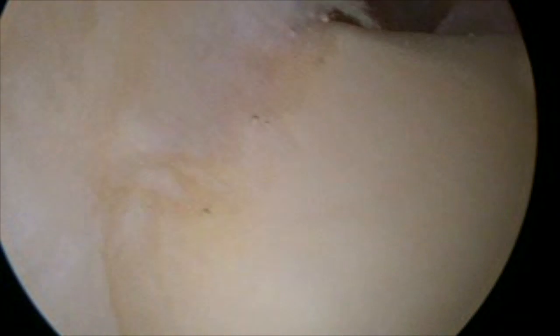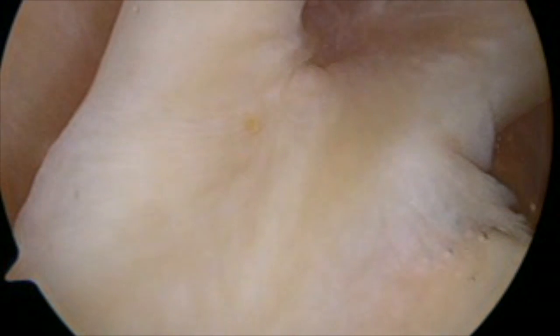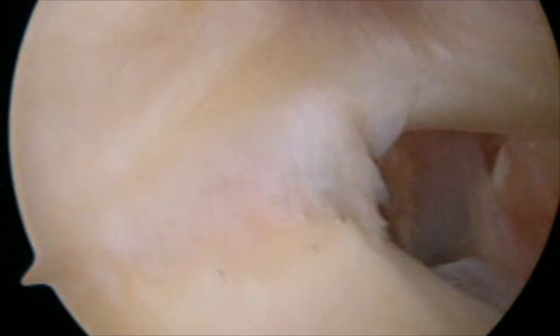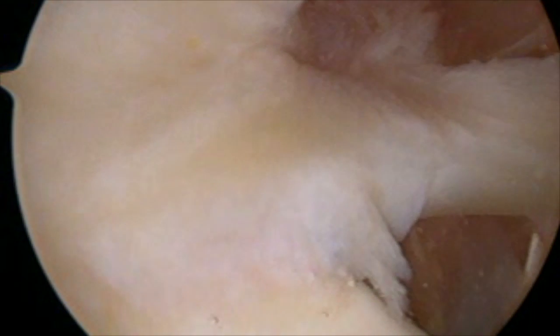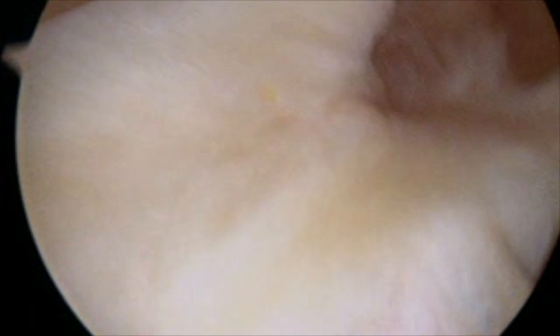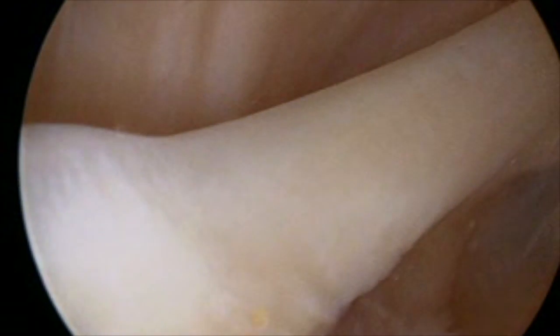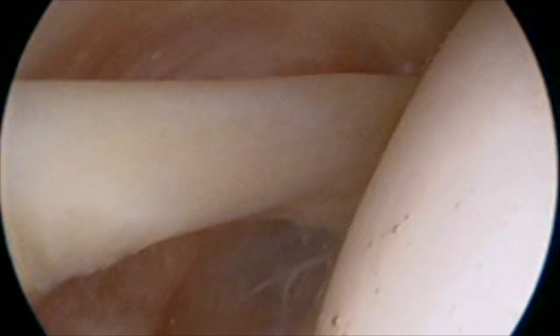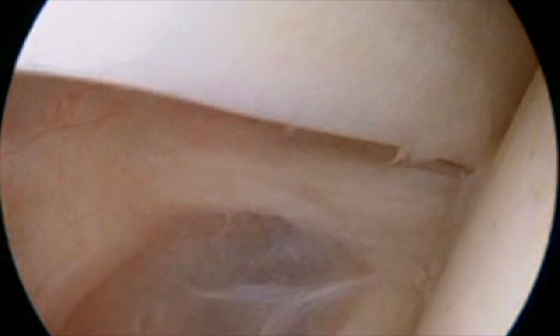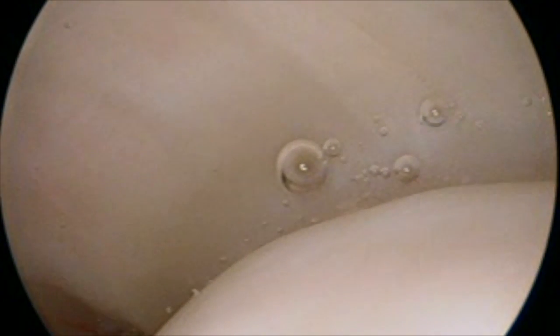And now we're moving up to the top. This is the superior labrum. This person has what I would consider a type 1 SLAP tear, just a mild fraying of the superior labrum. Now we're going to look up towards the biceps. What we do is we rotate the camera to follow the biceps out to the outside of the joint, and that's where the biceps exits. And now I'm looking at the bicipital sling of the superior glenohumeral ligament, and finally the rotator cuff.